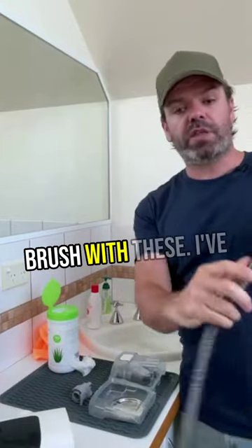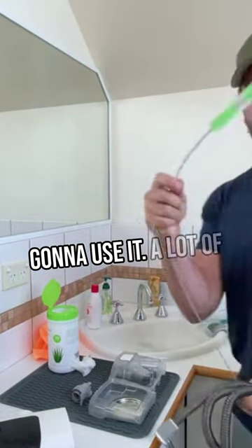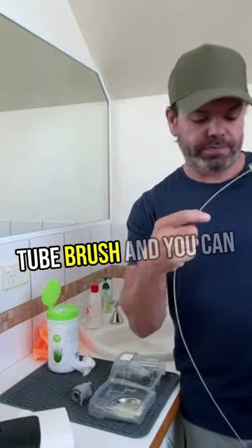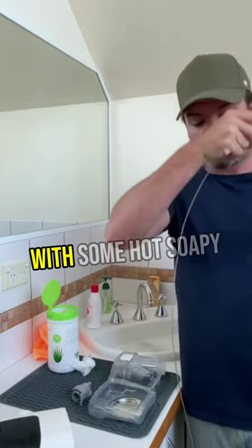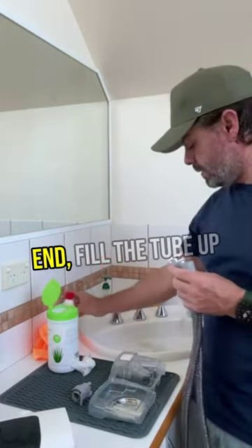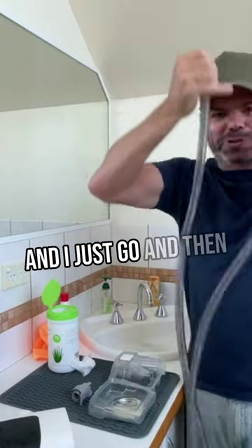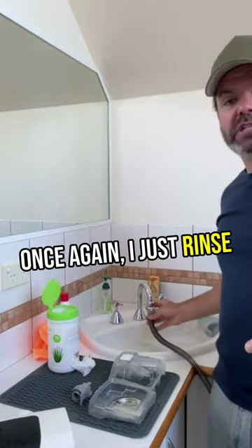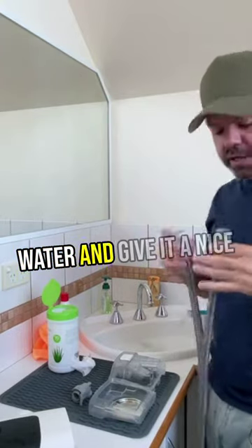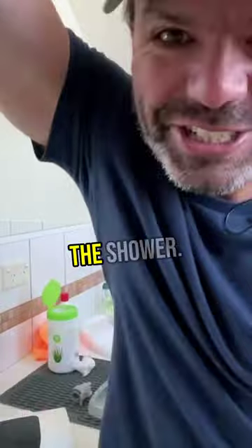You can use what's called a tube brush with these — I've got one here, though I'm not going to use it. A lot of people use a tube brush and run it inside the tube with some hot soapy water. I just drop a little bit of soap in one end, fill the tube up with water, put my thumb in either end, give it a shake, then rinse it out with fresh water. I normally just hang it up right here on the shower.